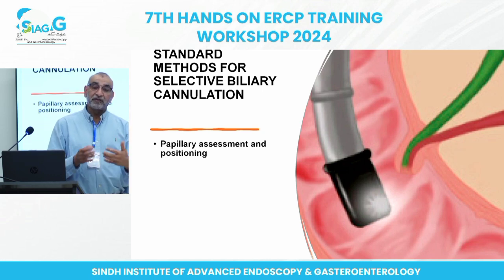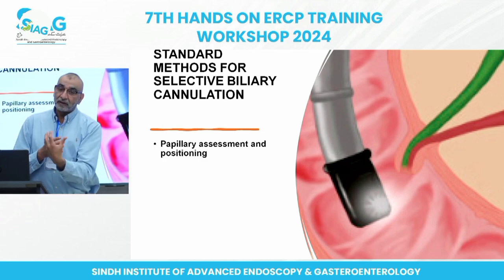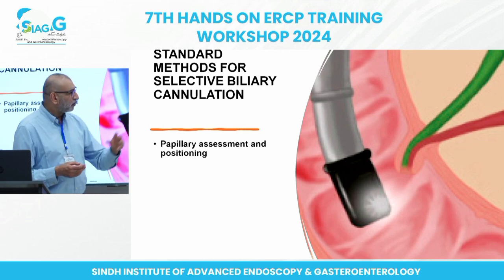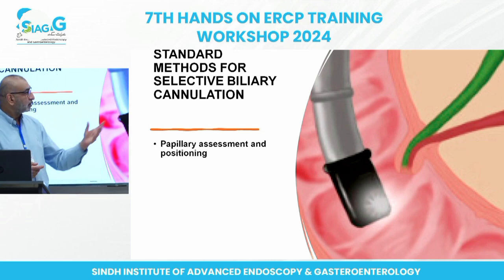I mean, not every patient is the same. When you get to the papilla, it might be in the diverticulum, it might be twisted around in an odd way. There are different shapes and forms of papilla, which we probably will discuss. I've got a presentation on that as well, but we can see where it is.